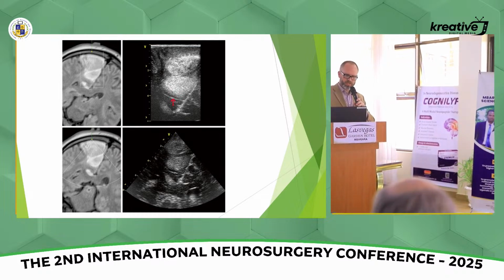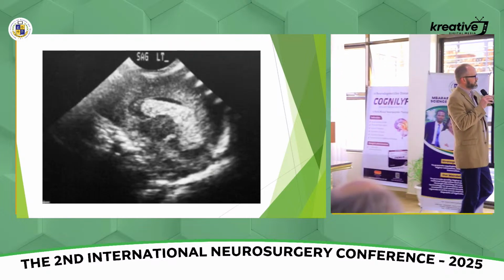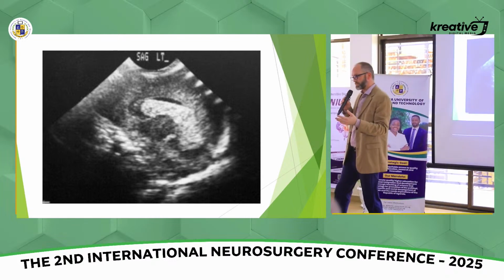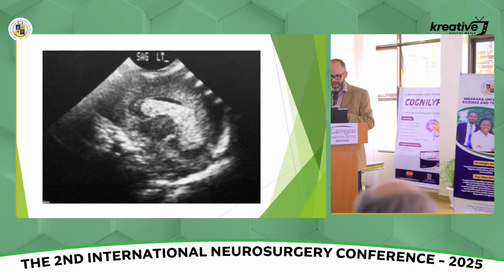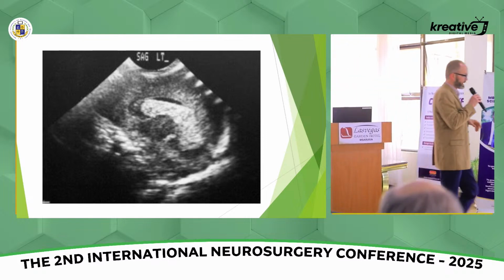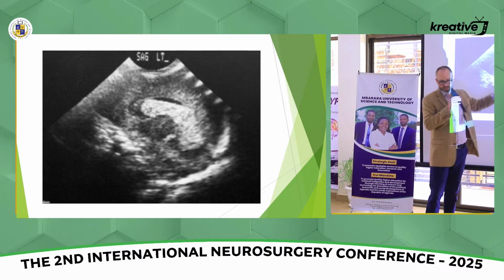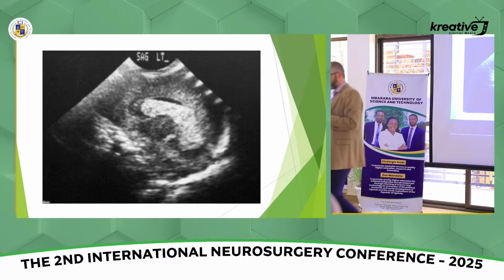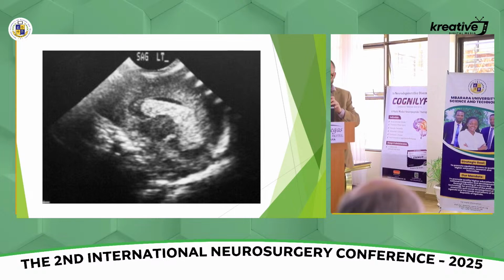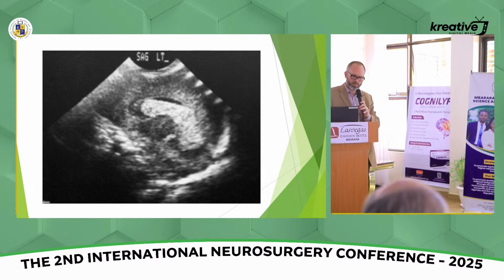This shows acute hemorrhage. This is a pediatric ultrasound showing intraventricular hemorrhage. And again, acute hemorrhage is bright, quite echogenic. As it becomes more subacute to chronic, it gets darker. Here you can see a fluid level, so this is acute but not completely clotted, or there's a layer of CSF above it. But at any rate, there's a fluid level, so you can appreciate that just like on CT or MR.